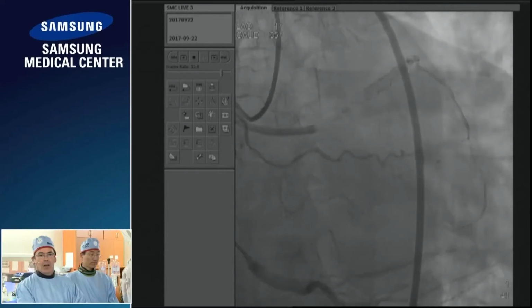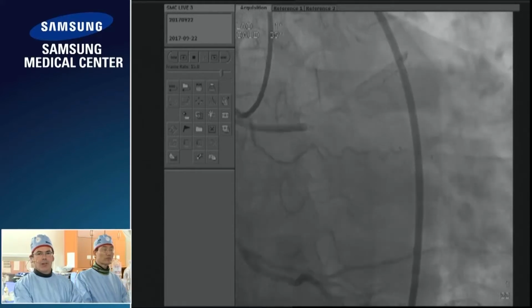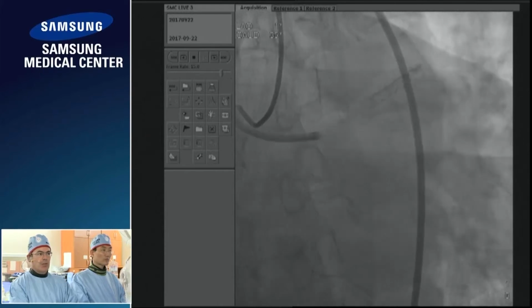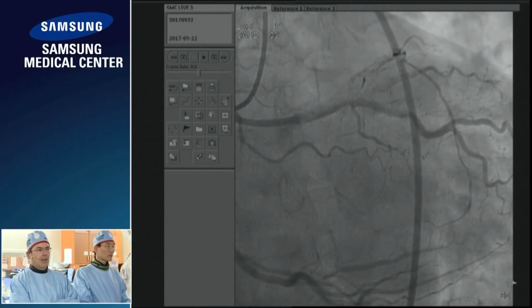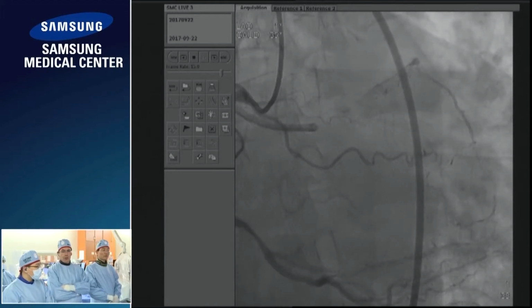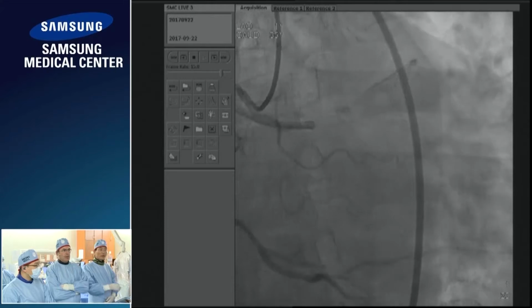Unlike a non-stented vessel, you don't have the challenge of going into the subintimal space and generating a large hematoma. It's contained within the stented segment. So you can use the blunt dissection technique, and we've had very high success rates using Crossboss in this particular context. I think we've got some slides. Could you go, please.